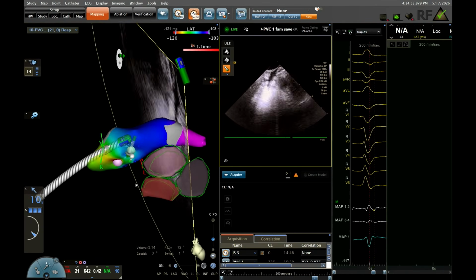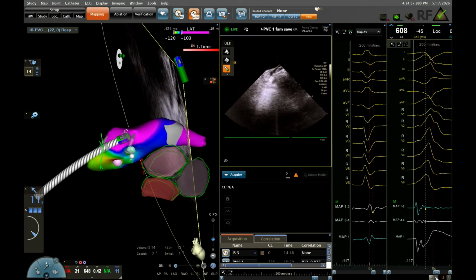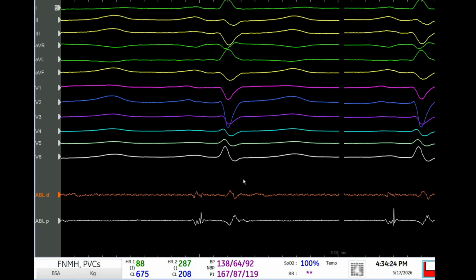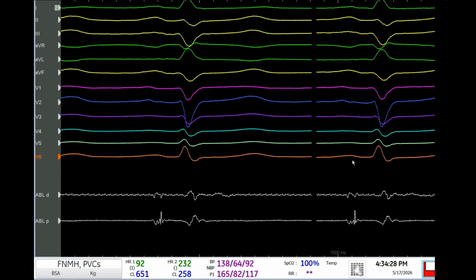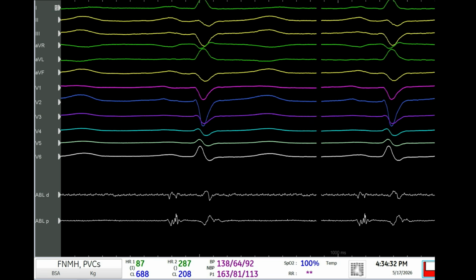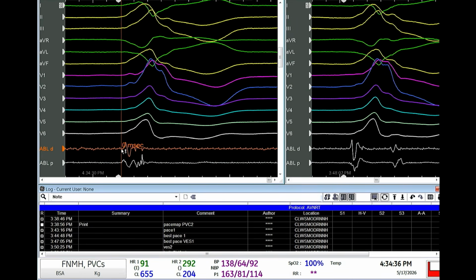That's a PVC. Show that now. Show it live, the PVC on Prucka. Can you show it on Prucka? The PVC just now? Can he show it on Prucka? Is that the PVC? No, go back, go back. There, you see that? You start getting earlier for the PVC that looks wider.